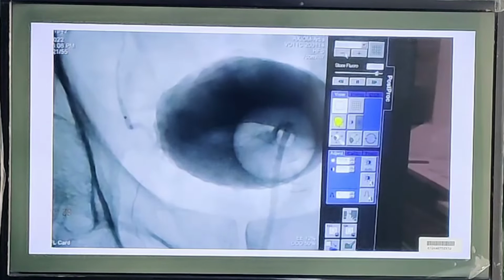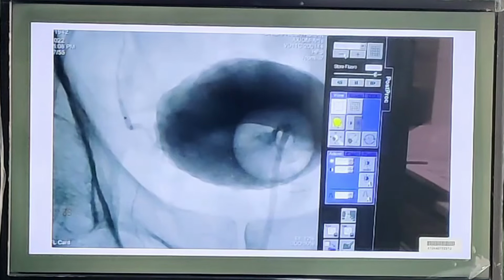So this is how the prostatic artery is cannulated on the right side. Now you can see the tip of the microcatheter. The dye is slowly filling the prostate on the right side, and this is the blush because of the gland enlargement. There is a lot of blood being absorbed into the prostate gland. This is the Foley's catheter which the patient had for almost 2 weeks.